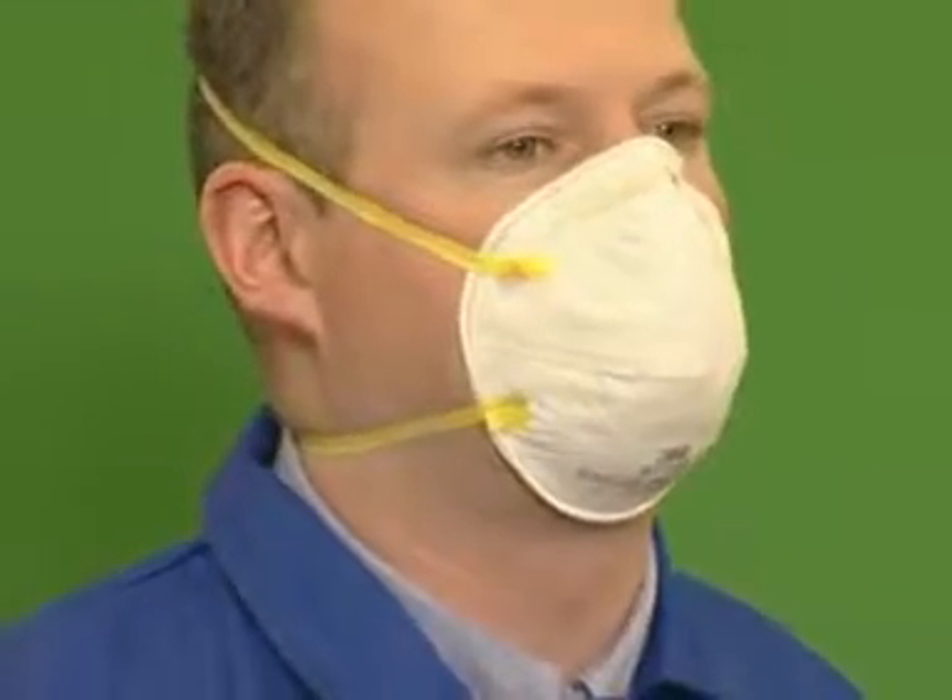Next, perform a fit check by covering the respirator with your hands. Exhale sharply. You should feel a slight positive pressure within the face piece. If you do not, reposition the respirator and nose clip and repeat the check.